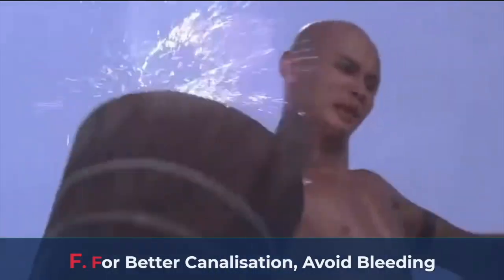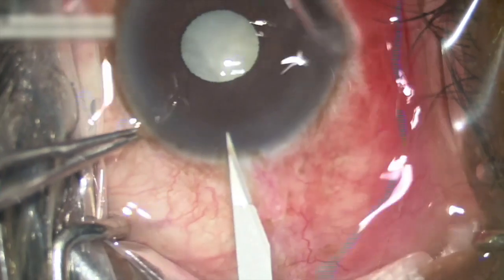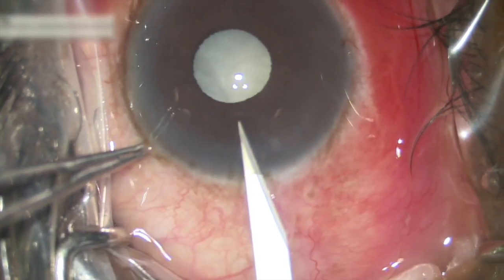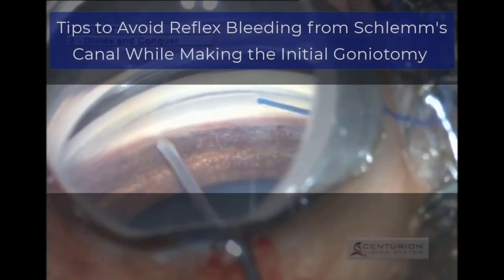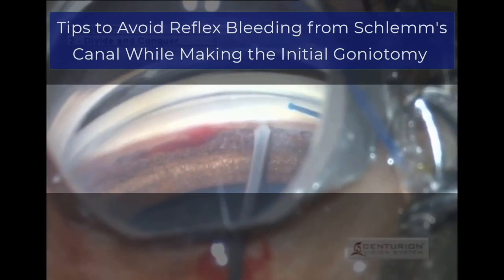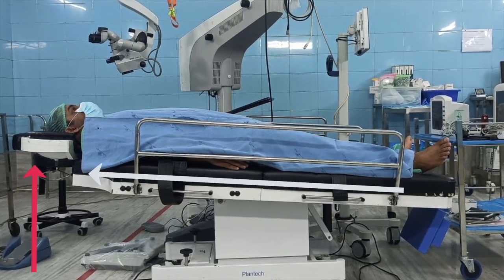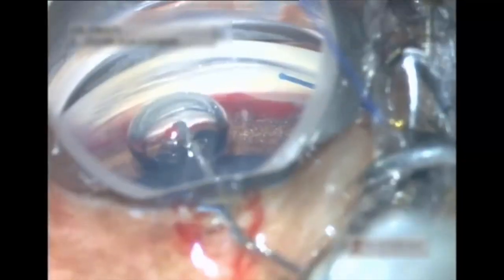F. For better canalization, avoid bleeding. Make all incisions on the clear cornea to avoid any bleed from the limbal vessels, as this can result in poor visualization. Tips to avoid reflex bleeding from Schlemm's canal while making the initial goniotomy. Keep the patient's head above the heart level by lifting the head of the bed in a reverse Trendelenburg position. Also, pre-fill and pressurize the anterior chamber with high viscosity OVD.